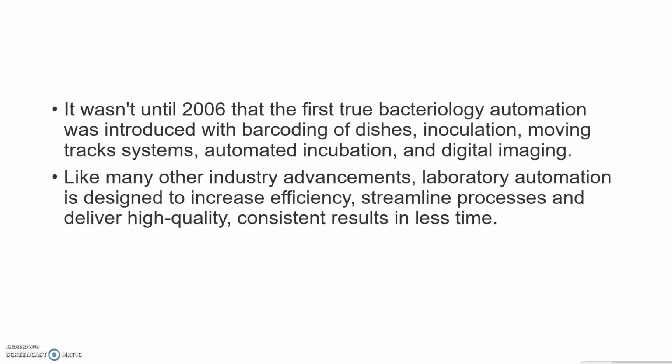It wasn't until 2006 that the first true bacteriology automation was introduced, with barcoding of dishes, inoculation, moving track systems, automated incubations, and digital imaging.